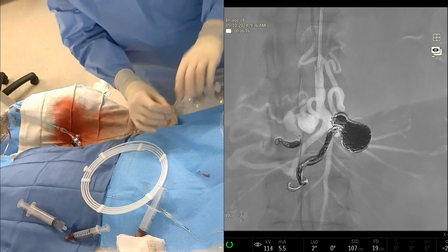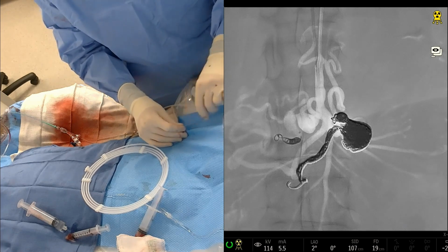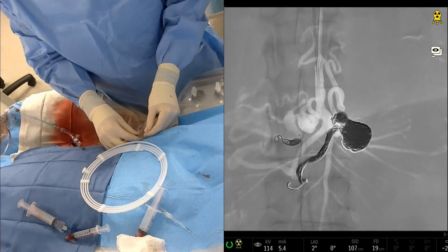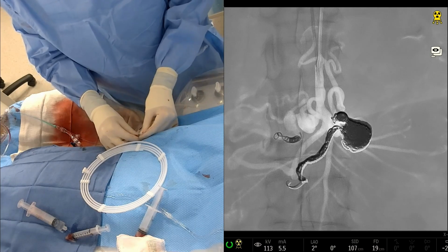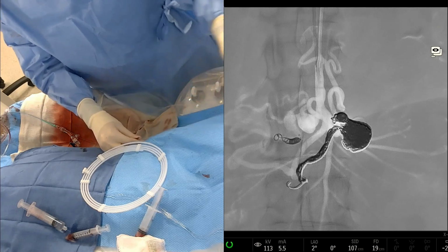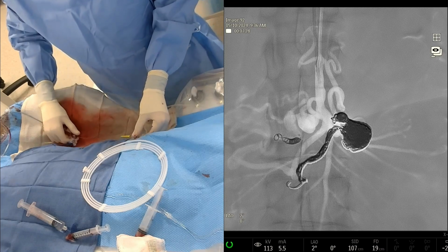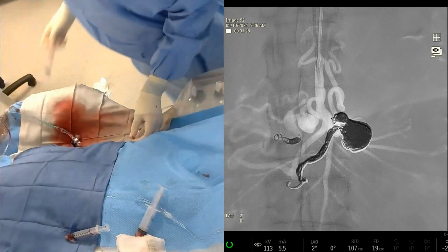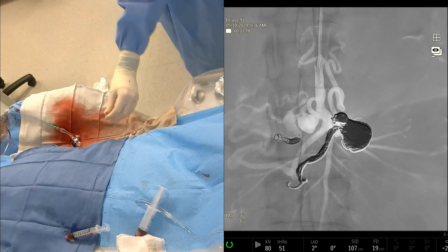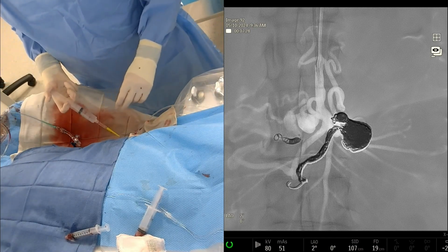Do we have another 6x60 packing coil? We're just going to pack our way back, I guess. Do you feel that the packing coils are softer than the standard Embold, Rahul? I get the sense that they are when I use them, but it's probably just because they're not fibered. It's basically a longer, slightly larger version of their packing. Yeah, that one, 60.